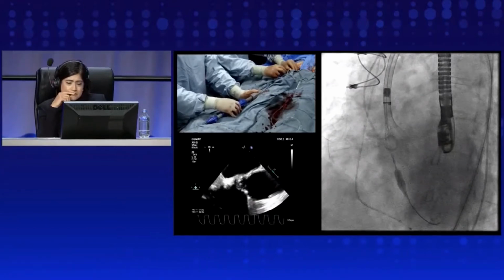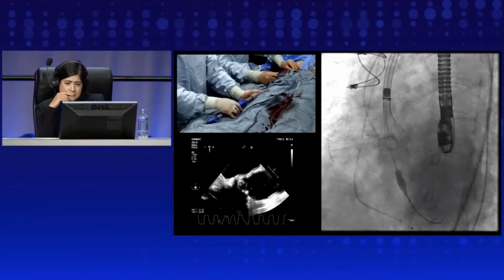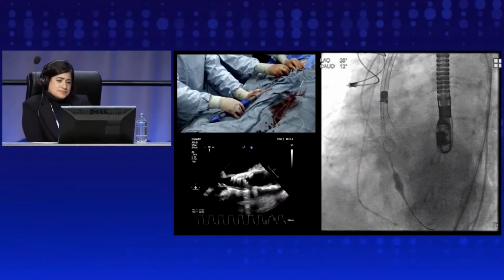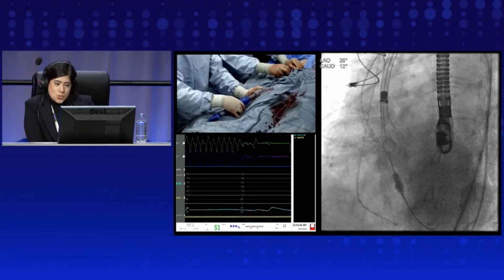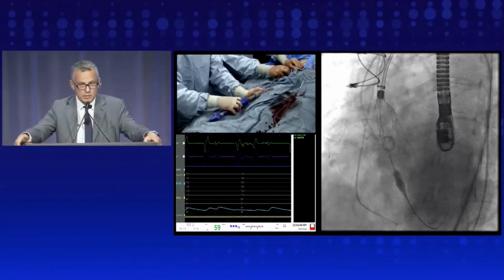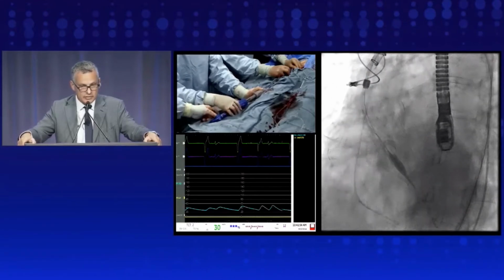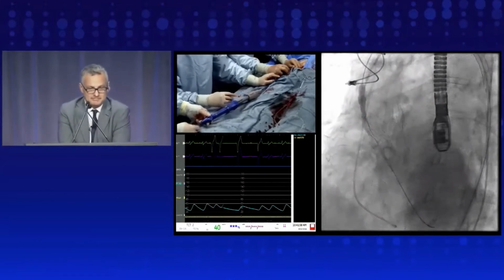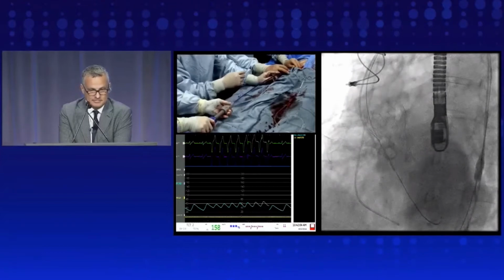Pressure came back. Not yet. A little bit more. A little bit more. I'm out. Why don't you turn the pacing off? Lost the pressure. Pacing off, please. Pacing off. How is the blood pressure? The valve is not opening yet. So at this moment there is still some obstruction in flow because I think it's a very narrow anatomy, and it's always a challenging step. Quick return of the pressure here. Pressure is coming back. Yeah, we got it now. Okay, we're pacing at 80.